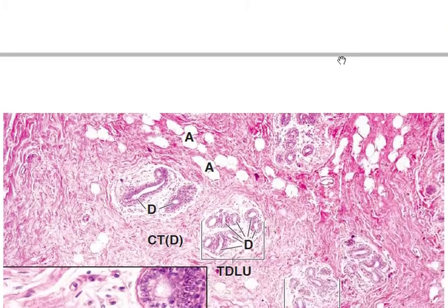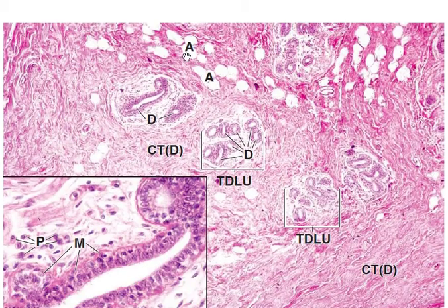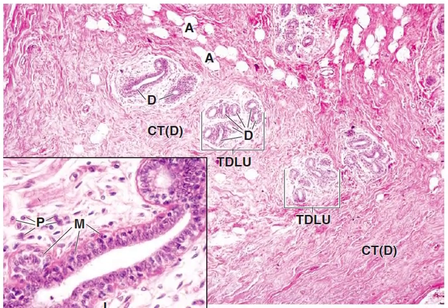So now let's check out the breast tissue. All right, mammary gland, inactive stage. Inactive mammaries. The mammary glands are branched tubulo-alveolar glands that develop from epidermis and come to lie in the subcutaneous tissue, the superficial fascia.